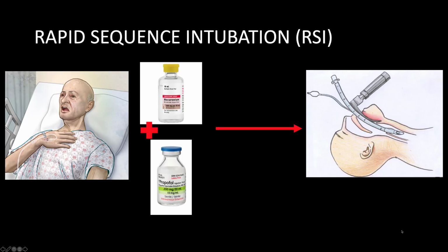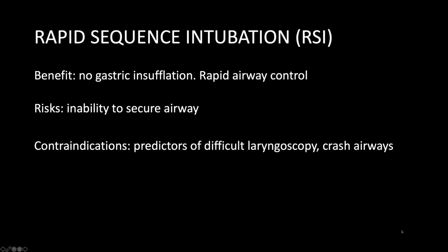So starting off with the definition of rapid sequence intubation, it's pretty straightforward in that it's a procedure for endotracheal intubation in which you administer a potent induction agent followed immediately by a rapid-acting neuromuscular blocking agent with the goal to produce a state of unconsciousness and paralysis, and you do not typically intervene with ventilations during the apneic period. It was originally devised as a method to reduce aspiration in non-fasted patients, but has now progressed to being the generally safest accepted means to emergently control a patient's airway.